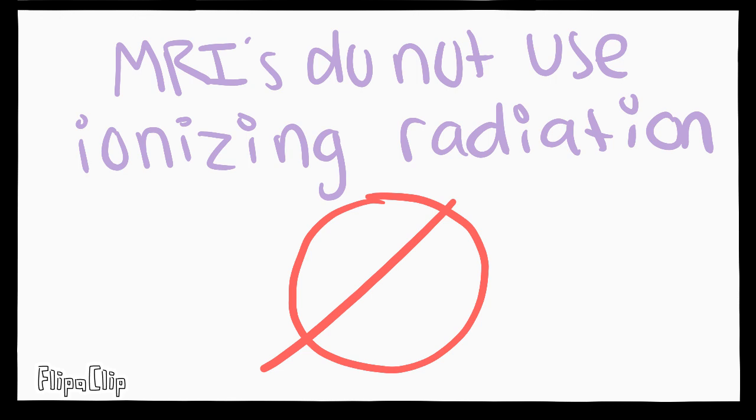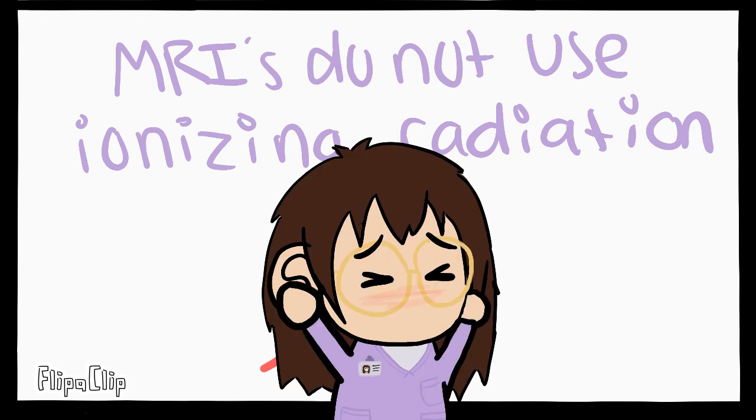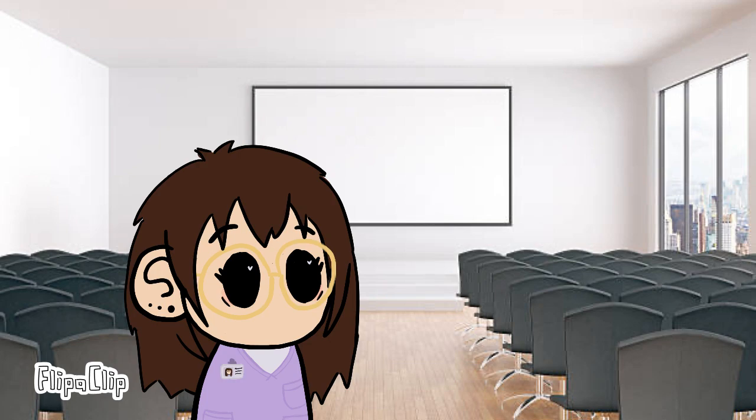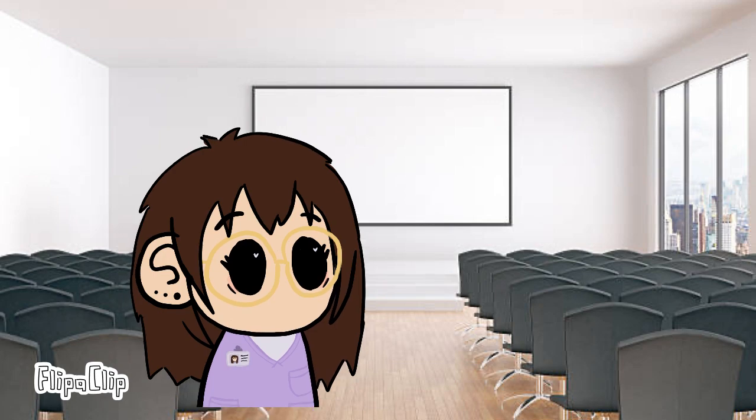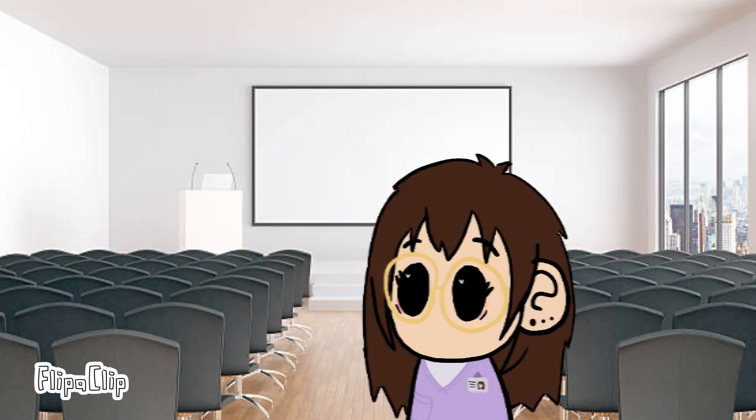MRIs do not use ionizing radiation, so they don't harm you. However, you might feel a bit uncomfortable because of how loud the machine is. The sounds might be alarming, but that's just the magnet doing its job. Though the procedure itself should not hurt you, an MRI machine can be dangerous if safety precautions are not followed.